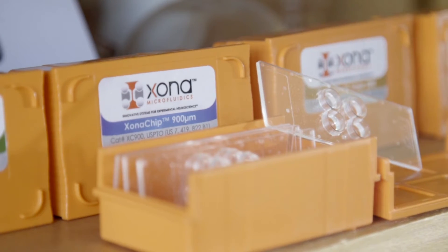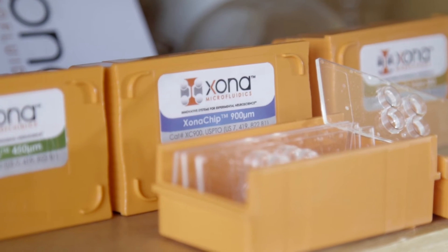To my knowledge, there is no product on the market currently like the Zona chip. It offers much lower cell toxicity, in my opinion, and much more reliability as a result.